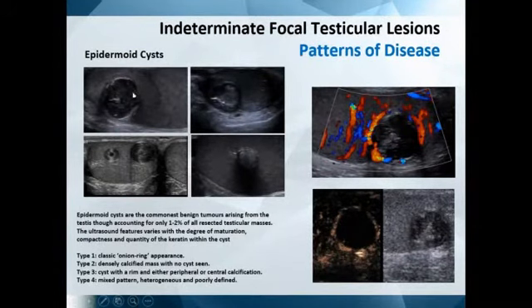Epidermoid cysts are true cysts. They are benign entities, but they have variable appearances on ultrasound. They're not all the classical onion skin appearance of epidermoids, but may have quite a lot of variation, from the normal onion ring appearance to a mixed, heterogeneous, poorly defined calcified area. You will see no color Doppler flow because it is true caseous material in a cyst, and the contrast-enhanced ultrasound will show no flow within that lesion completely.